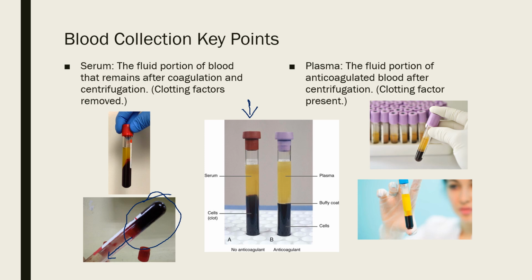Now there are some variations in your serum tubes. You could have some that have that little gel separator in it. This is not one of those. So this will be your gold tubes. They're kind of a yellow color, but most people refer to them as a gold tube. They're going to have a little layer of gel in them that you'll see in there. And your gel separator will also be indicated by what they call a tiger top tube.